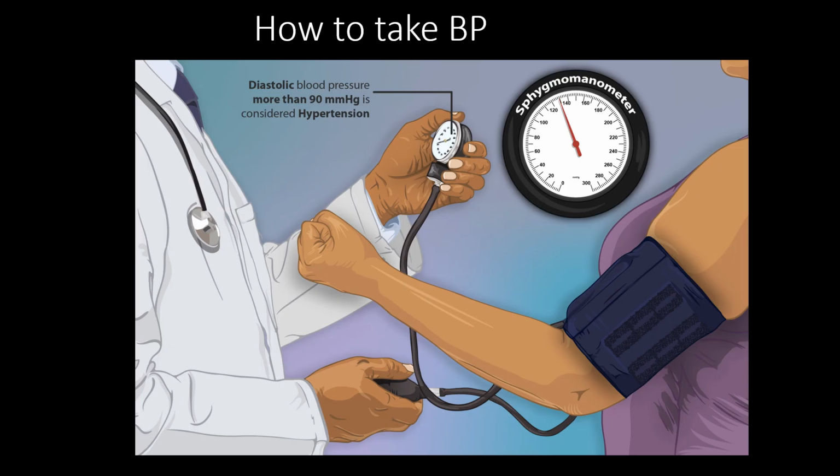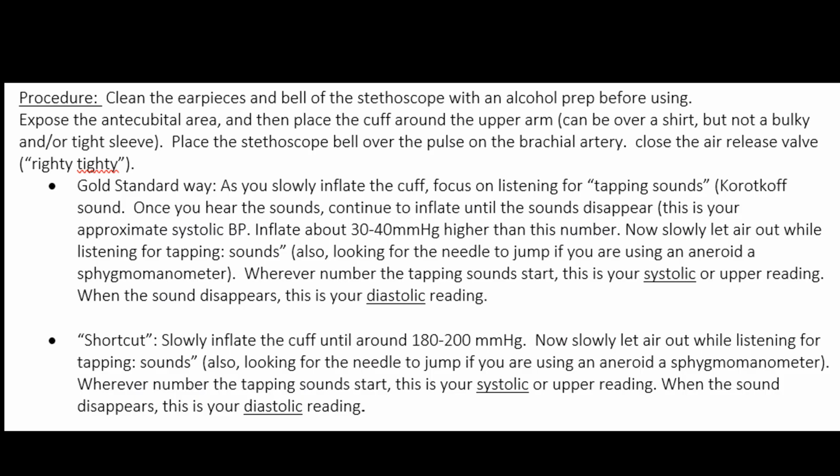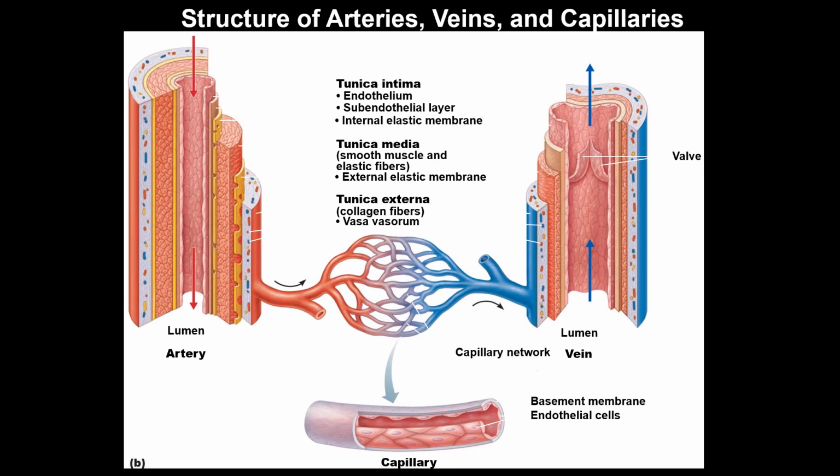So how to take blood pressure? This image shows you an aneroid blood pressure. Let's see if we have some digital sphygmomanometers in the lab. There's a procedure in your laboratory manual, but I also typed up a simplified procedure for taking blood pressure. Please make sure you review each of these, the standard way or the shortcut way that many of you will probably end up doing later on in a busy clinical schedule. Okay, let's leave heart sounds, blood pressure, and pulse, and we go to our blood vessels.